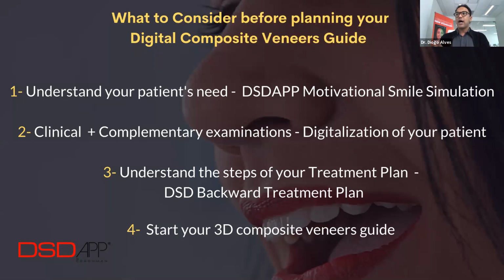And that's why I was saying before about having the patient become a co-designer of your smile. So as soon as your patient comes in your office, you listen to your patient, but you also let this patient know that you have this amazing application that will allow you to design a smile that fits the facial structure of that patient, which will create a harmonic smile. Look how amazing is that. You start your communication, your engagement right on the first visit.